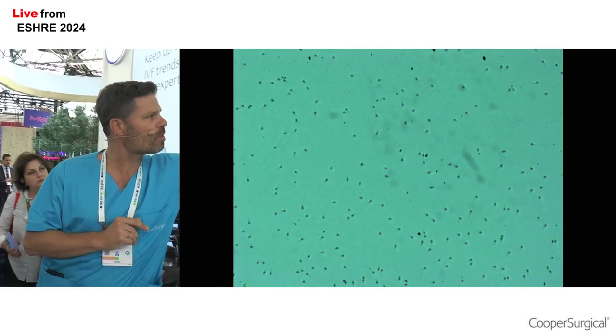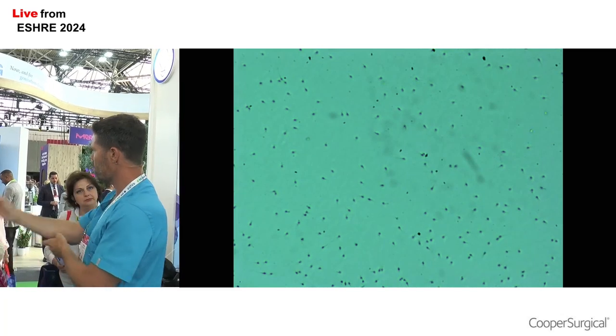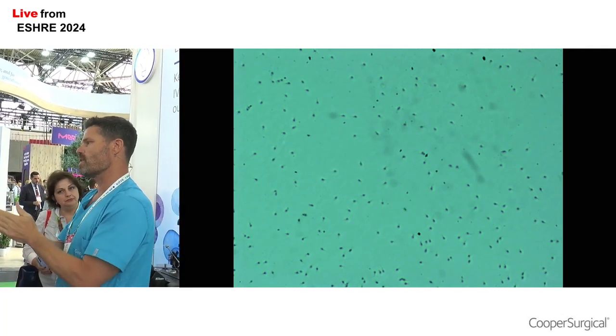So these are the sperm. This is what we're looking for. For example, you see the head is stuck, the tail is moving, quite often they'll be spinning around. And what we're going to do is we're going to select these sperm with our ICSI pipette.